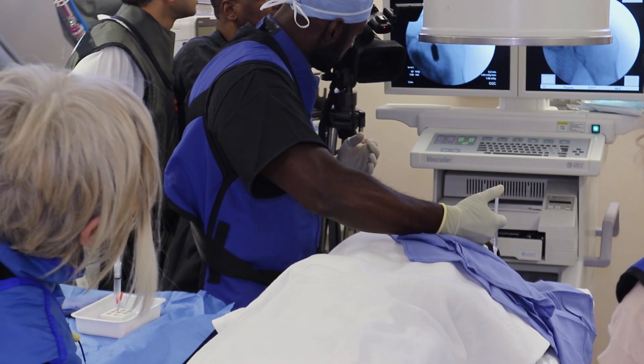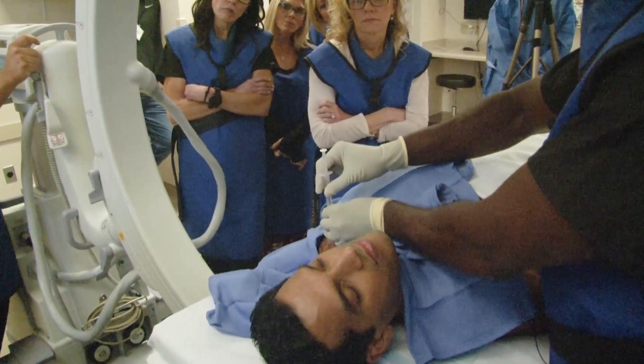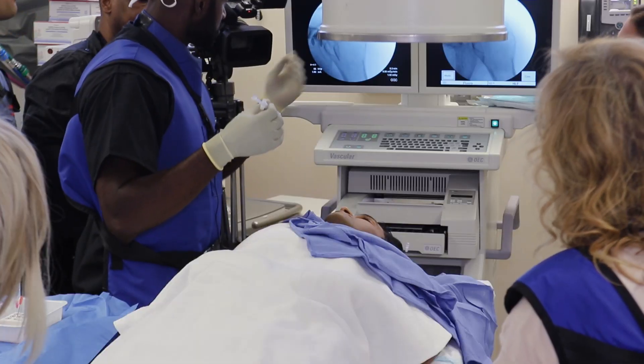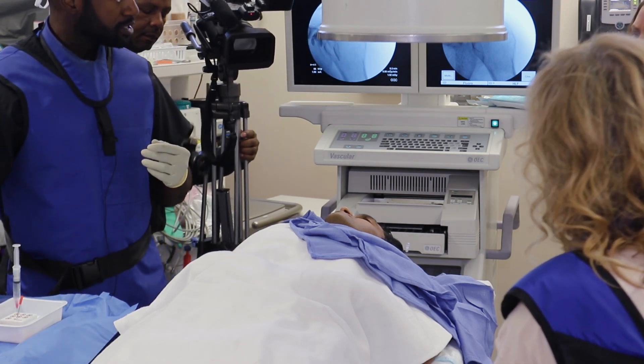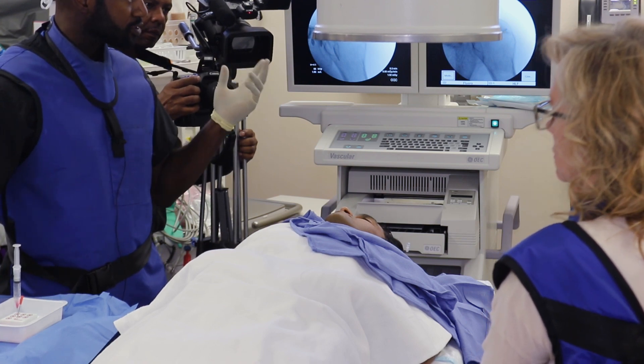Pressure. Floating into the space — that's what you're looking to see. Image. Beautiful, so you're getting wrapping around it more, that's what you want to see. What is that that you just put in? Contrast. Just make sure you're actually in the space.